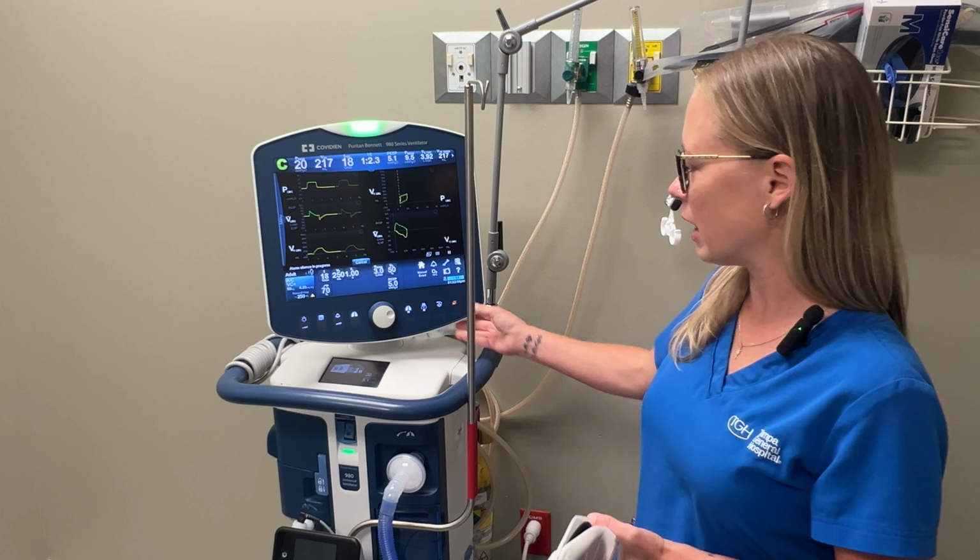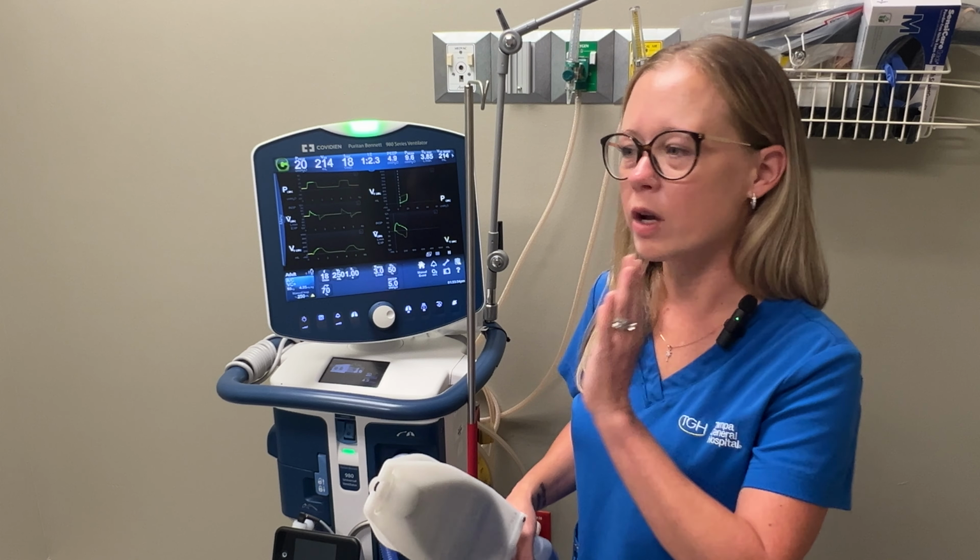This vent, if it were to become disconnected, it's going to alarm. All you have to do is reconnect the patient. The vent senses that you've reconnected them and it picks up right where it left off. You see these red lights here, that means that was a critical alarm, but you've taken care of it and you know your patient's all right. You can clear those red lights.